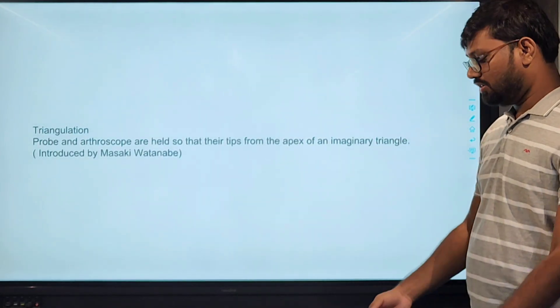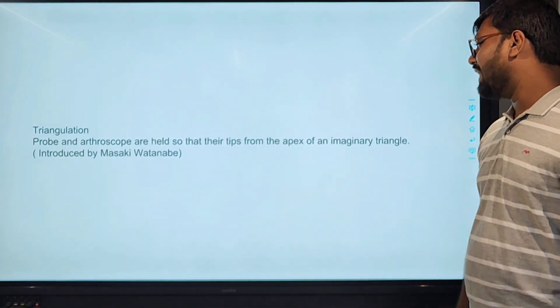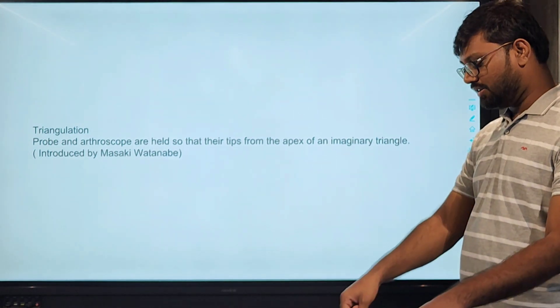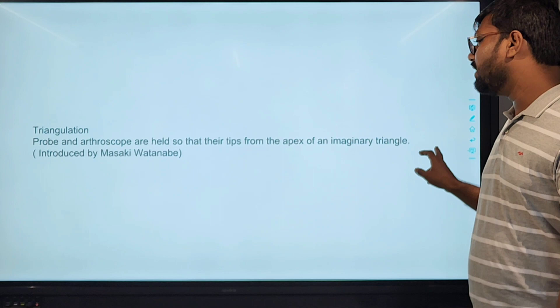Triangulation: the arthroscope and instrumentation — the probe and arthroscope are held in each hand so that they form an imaginary triangle. This is called triangulation.